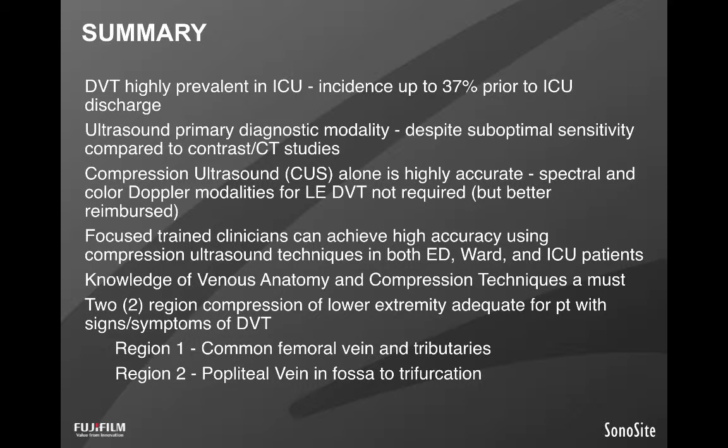So to summarize a lot of the points that I made, again, how prevalent is DVT in the ICU? Highly prevalent. You've got to watch out for it. This is an easy way on physical exam to look out for it. If I haven't mentioned it already, physical exam is miserable for diagnosis of DVT, and that's long been recognized in medicine. Well, now that we have ultrasound as the tool, it's excellent because it is the main diagnostic tool. It's what we always use, and it's shown to be quite accurate.